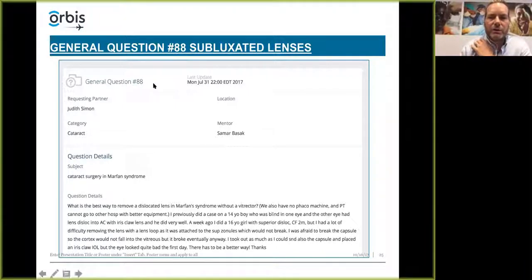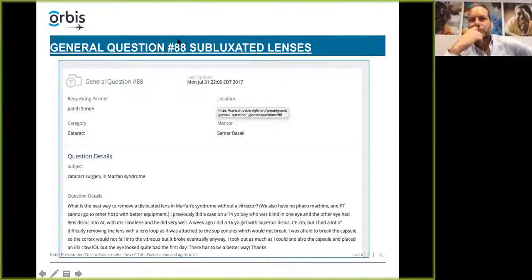All right, well, first of all, I don't think I ever plan to have a future explantation. I don't really anticipate switching the IOLs out, but either one of those will come out relatively easy if you do have to remove one, if you have a lens calculation that's way off. Both those 3-piece and the 1-piece will just dial right out without much fibrosis around them. So they're equal.